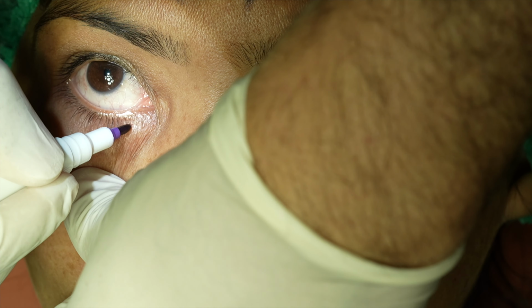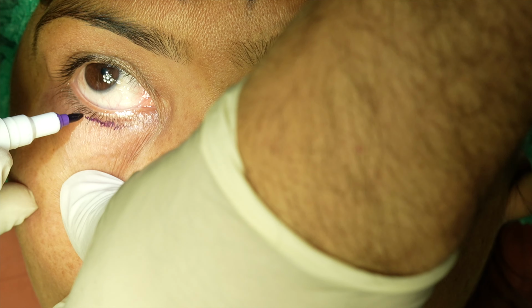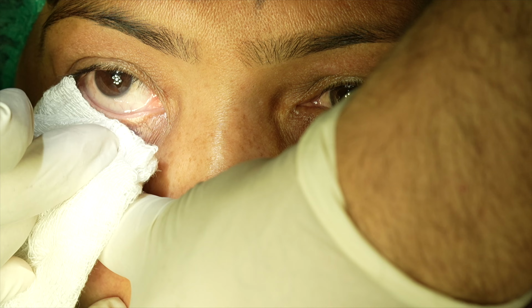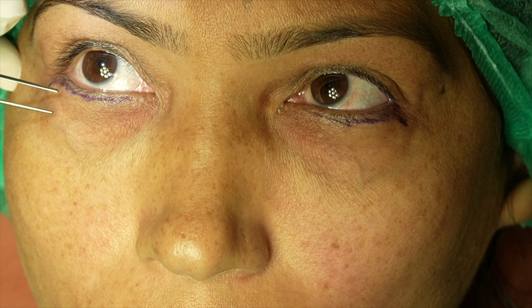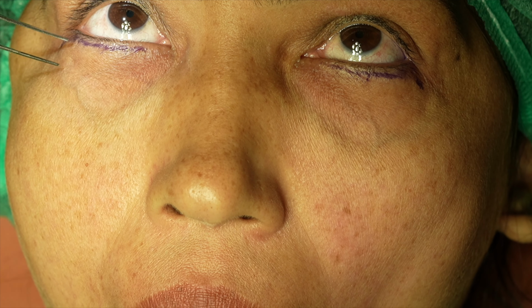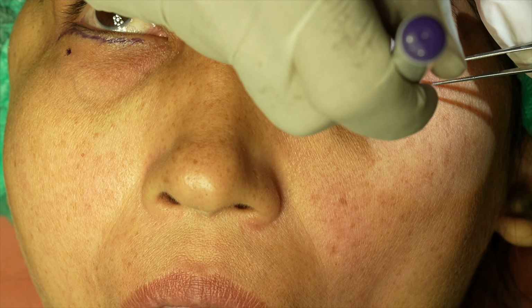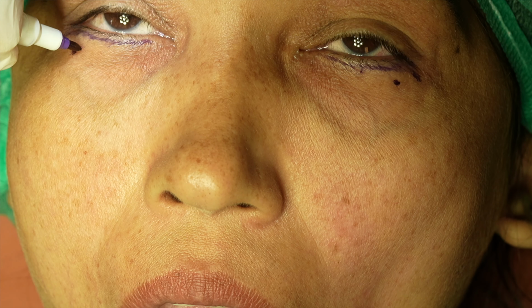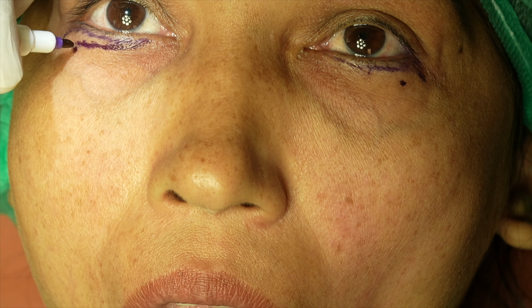Subciliary markings are made approximately 1 to 2 millimeters below the lash line, extending from punctum to the lateral canthus and then slightly laterally and inferiorly along a natural skin crease. A pinch technique is used to assess the amount of redundant skin. Skin excision is planned conservatively, especially medially, to avoid postoperative complications such as lid retraction.